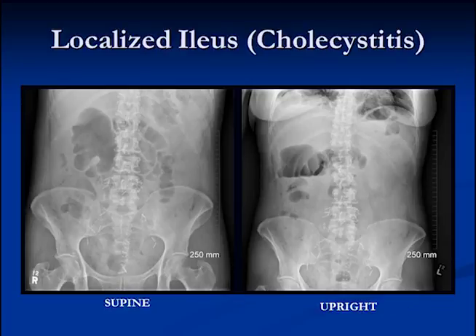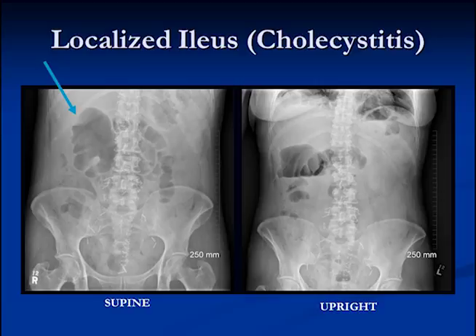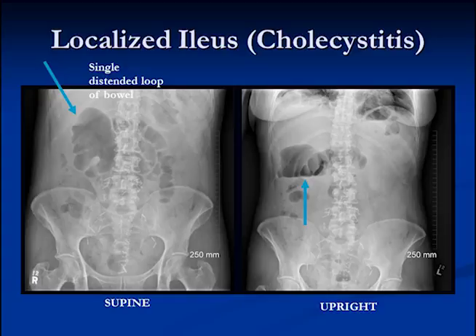This is a localized ileus sometimes seen in patients with gallbladder problems or inflammation. Here you can see a distended loop of large bowel, probably at the hepatic flexure. On the upright view there's an air-fluid level in that bowel, implying that that small loop is probably paralyzed. There are also mildly distended small bowel loops around there as well, and this is what we would call a localized ileus.